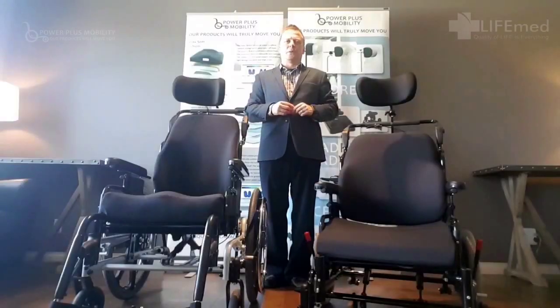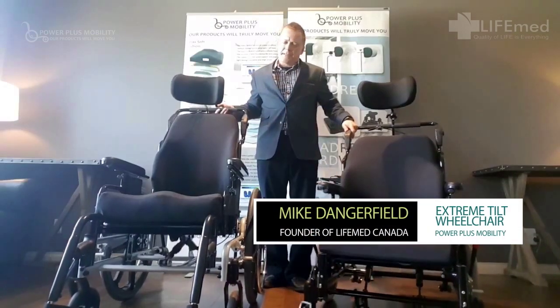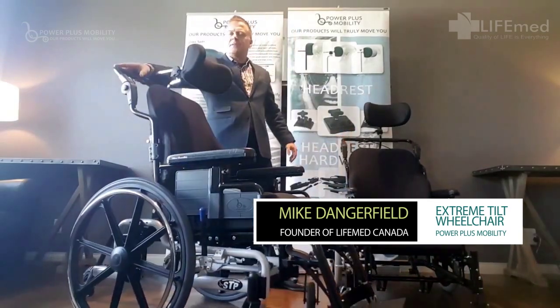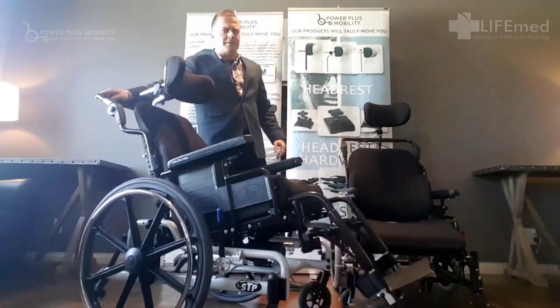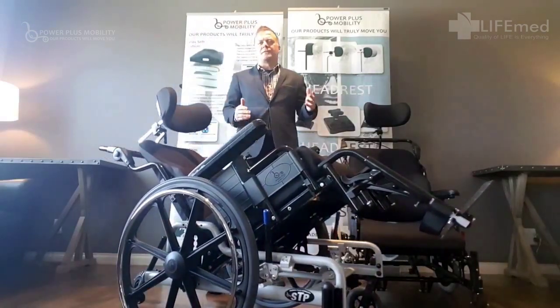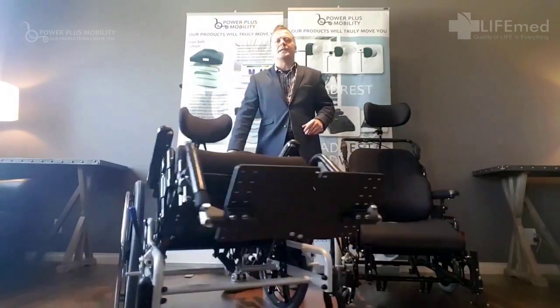I have with me two manual wheelchairs from Power Plus Mobility and they're both classified as tilt chairs, even though they're quite a bit different. The chair here on my right is the STP Tilted Space Chair. It's got one of the smoothest tilts I've ever felt on the market. We can easily achieve 35 to 45 degrees of tilt, and this is going to reduce pressure for the client and add comfort.